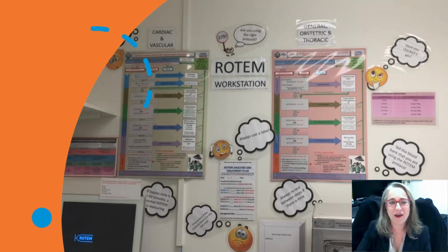So here I've got a picture of our very first Rotem workstation. On the bottom left, there's a Rotem machine, and on the bottom right, there's the blood fridge. And then there's the two original Rotem algorithms on the wall with a few reminders: should we always use a label? What's the hemoglobin? Are we using the correct algorithm? Tell the blood bank you're using the protocol.